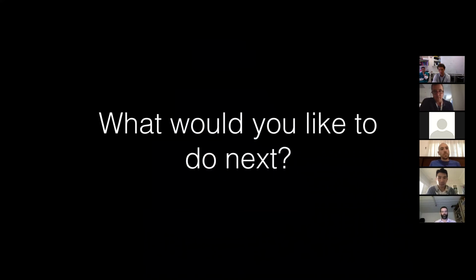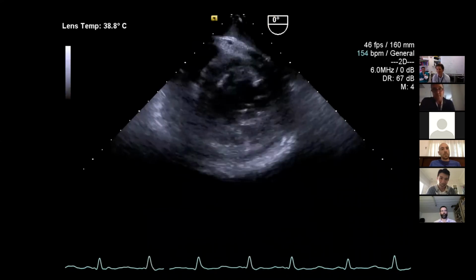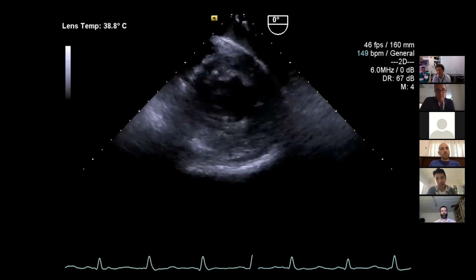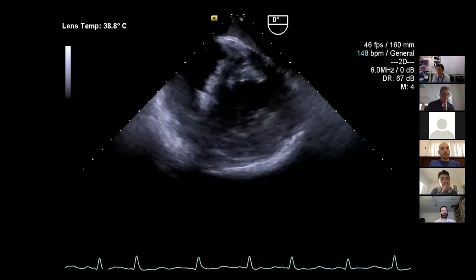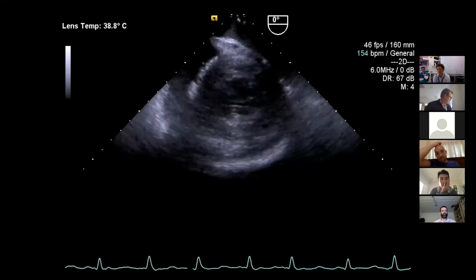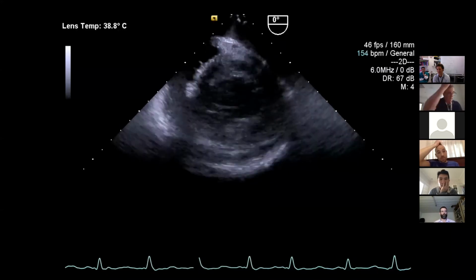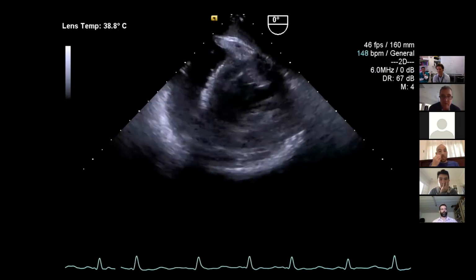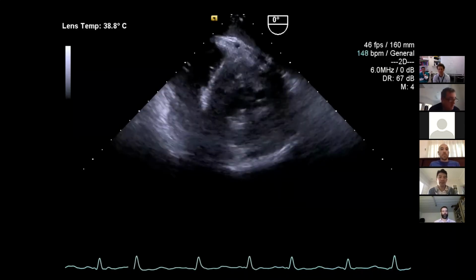So what would you like to do next? A TOE. Sounds good. Beautiful. Should we go on to the next one? Where are we up to? Carton, is this coming okay? Would you like to go through the TOE with me? Are you able to see the pictures okay, or is it jumping around too much? No, yeah, I suppose it's about 5 or 6 frames per second. Not magic, sorry.